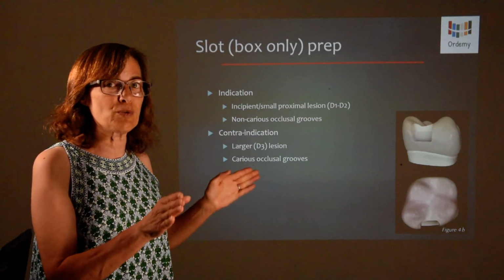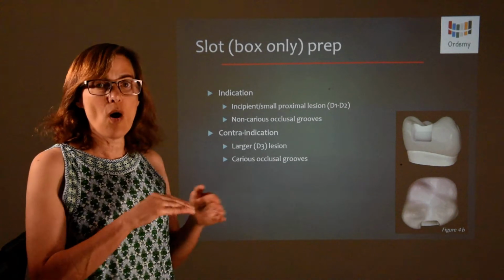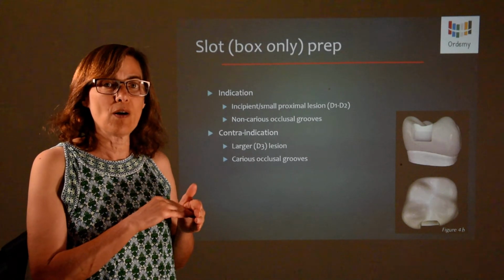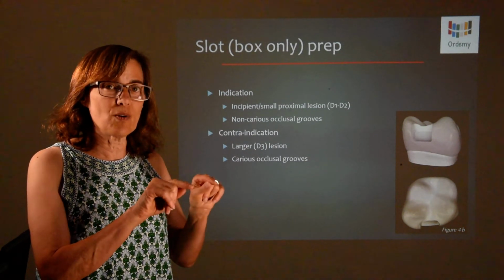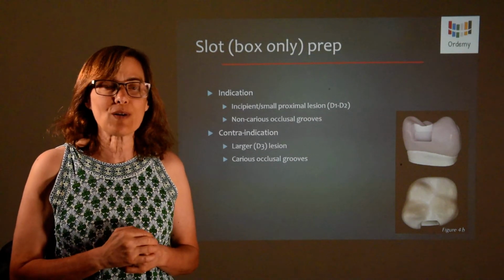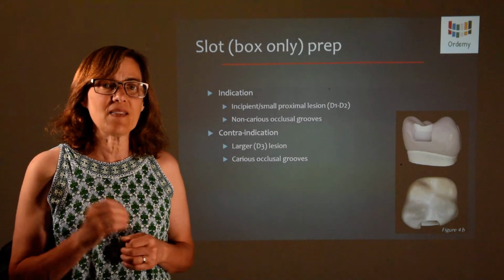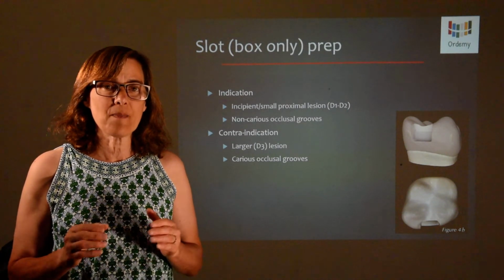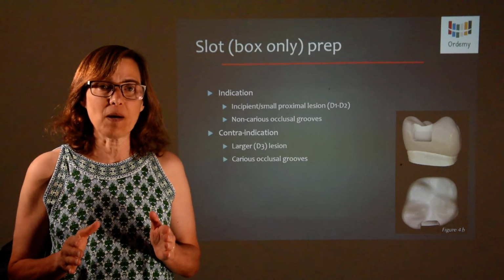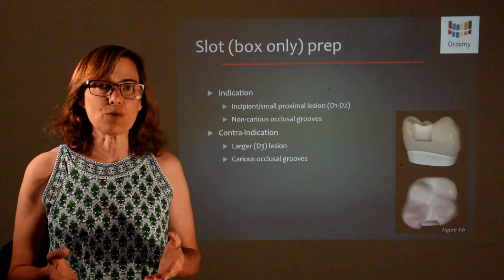There are grooves that go into the dentin, as well as on the axial pulpal floor. It's not a groove, but they're little indents. Those are essentially undercuts, and how the preparation will hold the amalgam is by the parallel walls and these undercut grooves.